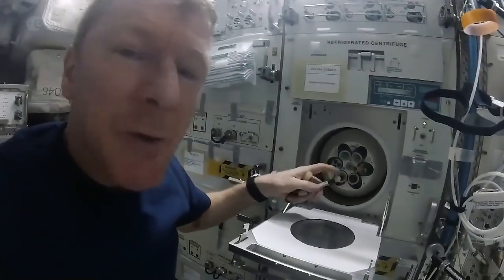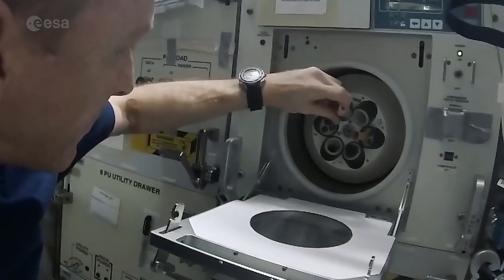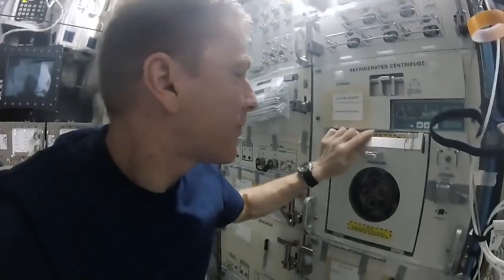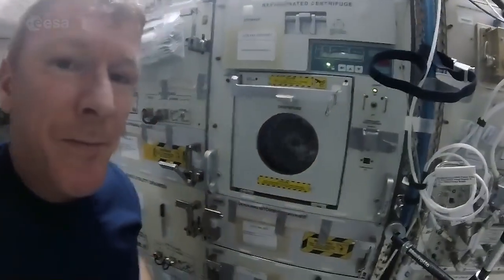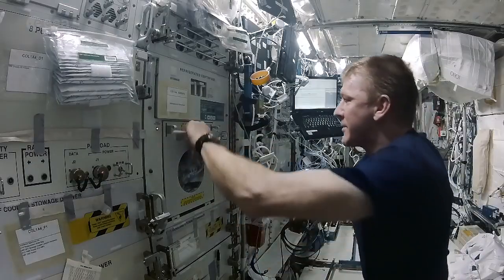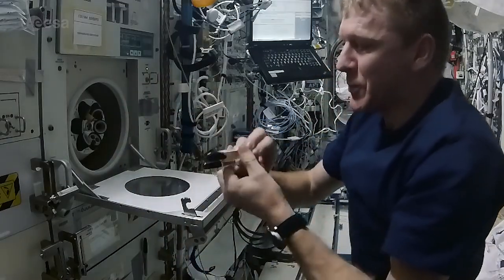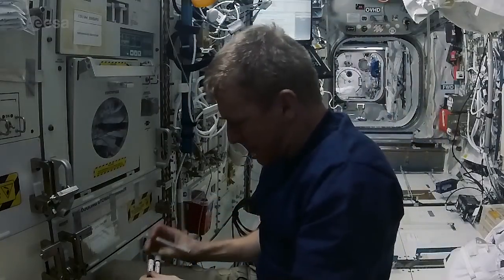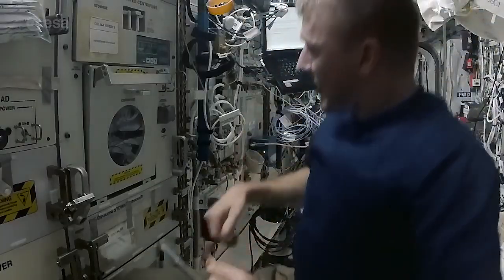In the centrifuge we've got a couple of counterweights so that it is equally balanced. All looks good, settings are all okay, and we just need to press start. The centrifuge has stopped and the door is now unlocked. There we have our two tubes. Just need to write my name, date, and time on them. Ready to go over into the freezer.